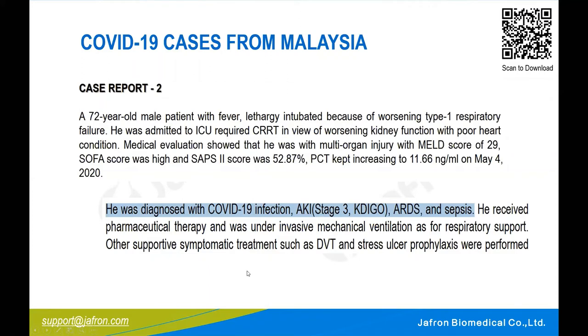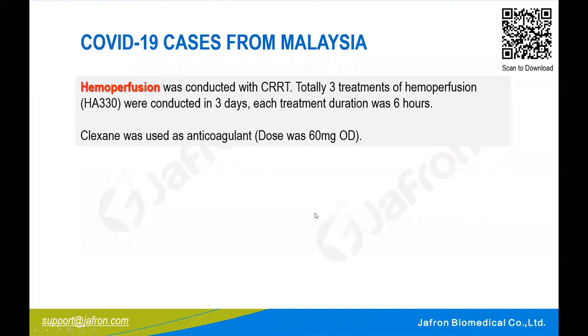He received drug therapy, and he was under invasive mechanical ventilation for lung support. He also received some supportive symptomatic treatment to help him recover. At the same time, this patient received hemoperfusion combined with CRRT, totally three sessions of this hybrid extracorporeal blood purification treatment, conducted in 3 days. The duration of each session was 6 hours, and low-molecular-weight heparin was used as the anticoagulant.